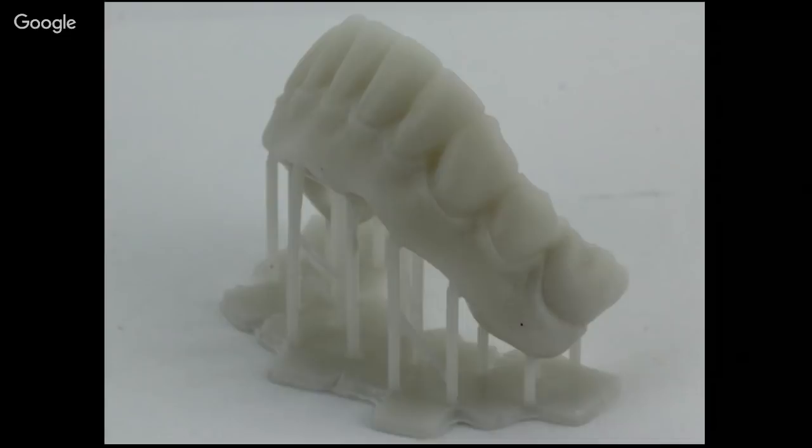However, if they choose to go the route of doing physical denture teeth, then they'll be able to, of course, plan it using the STLs. But when it comes to the point of exporting, they'll only be able to export the denture tooth reduction coping and the bases, but not the teeth. And that's going to protect those manufacturers' teeth.